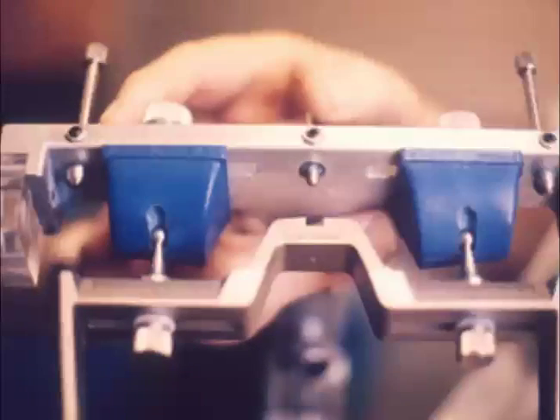In the right working path, the balancing Bennet and orbiting paths, and back to centric. The centric pin is depressed to position the condylar elements in centric relation. So now he could put these custom analogs of motion onto the articulator to duplicate the patient's actual jaw movements.